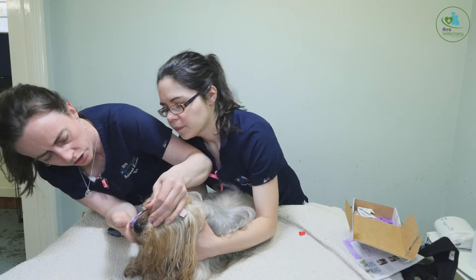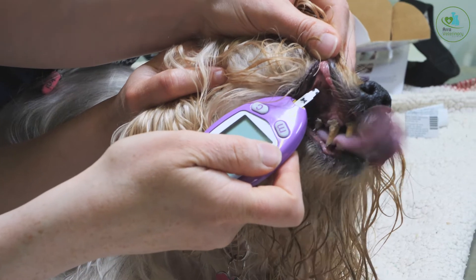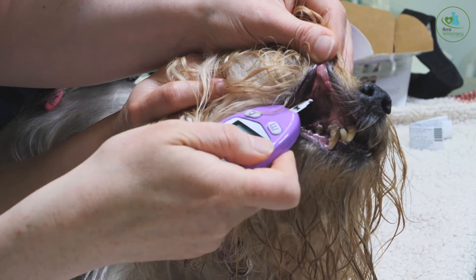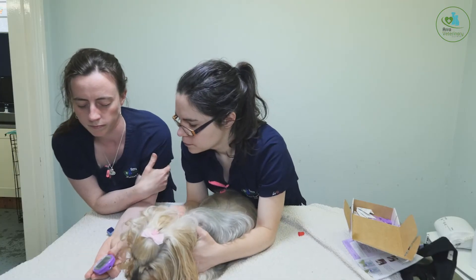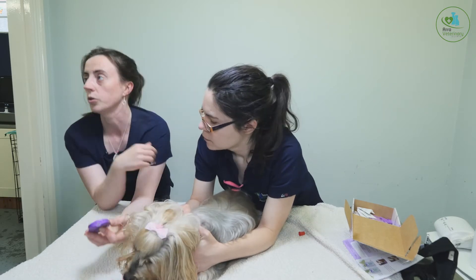You wait for a little drop of blood to appear, then wait for your blood sign to come up and collect it off the edge. So 11.7 is her blood glucose reading at this point.